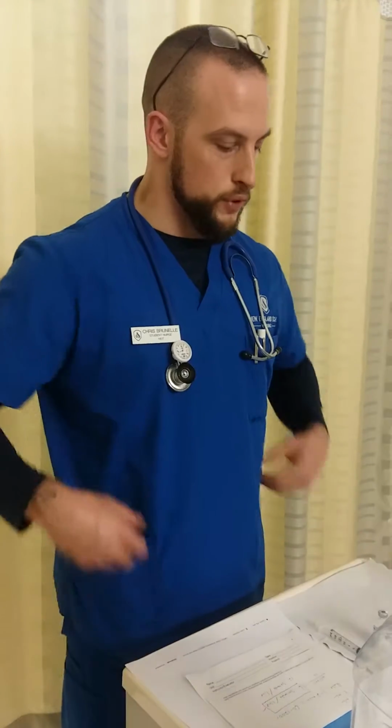Is it the correct medication? Is it the correct time to give the medication? Is it the correct route? I would also double check patient allergies within the medication administration record, and then compare the medication administration record to the medication, double checking the expiration date of that medication and if it's in stock or not, which it is. So I have my medication here, so now I'm going to draw the medication.